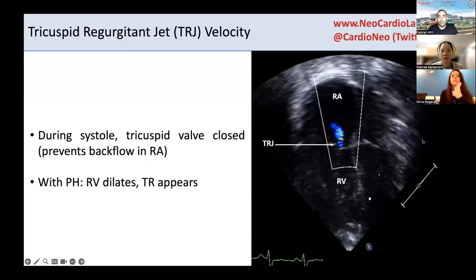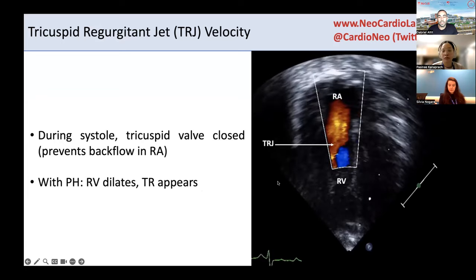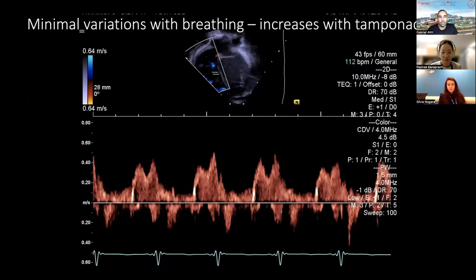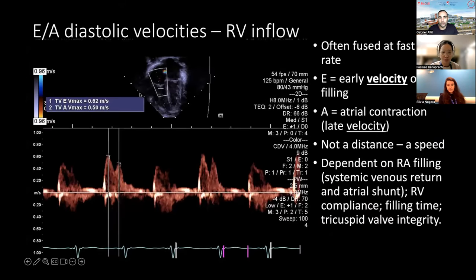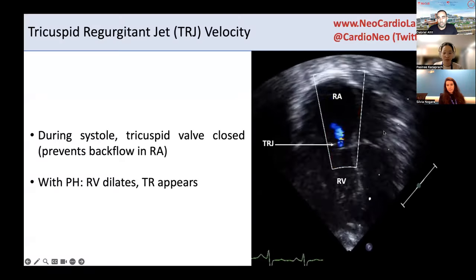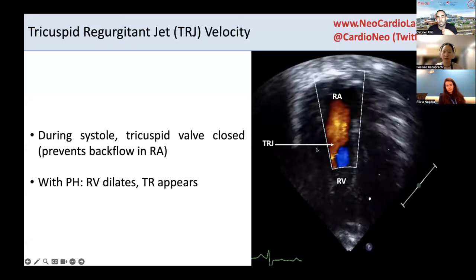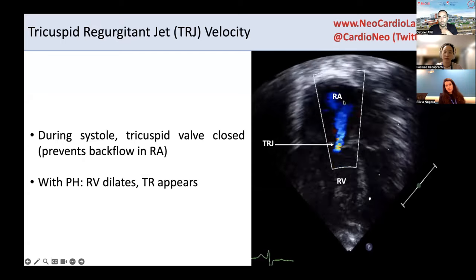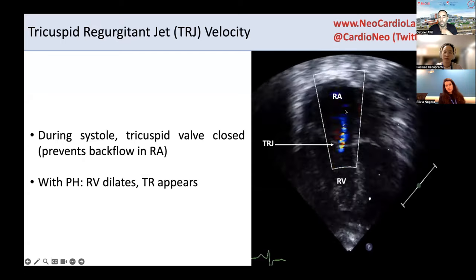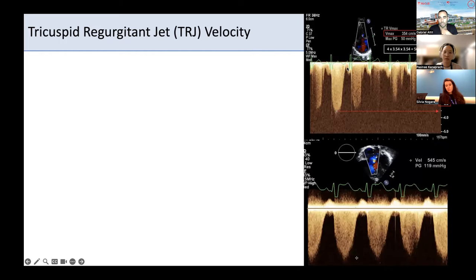TR. So you can use now the opportunity of continuing. These markers are done by pulse wave Doppler, because it's an instantaneous velocity that you're interested in. So it's PW. Now you can apply this to the regurgitation of the atrioventricular valves: you can do a continuous wave Doppler if you get regurgitation. The continuous wave Doppler informs you on the velocity across the entire line of interrogation.